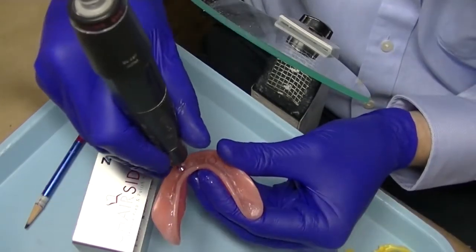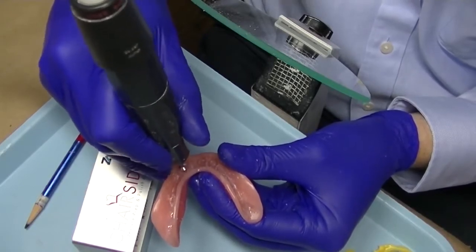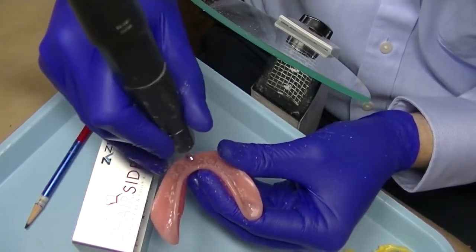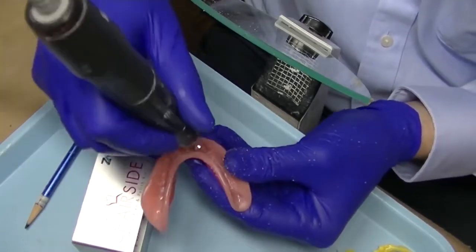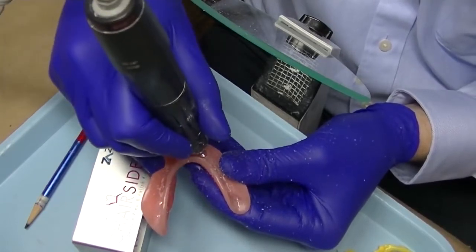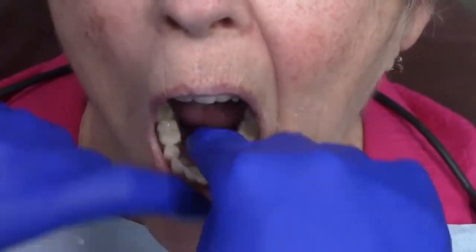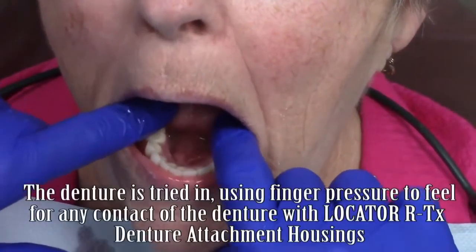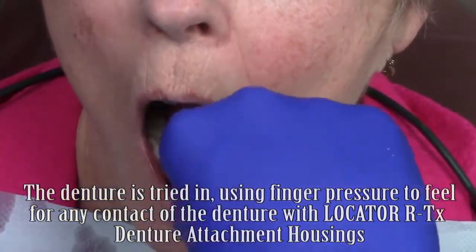Any areas of show-through are very easily adjusted and modified using the chair side recessed burr. The recessed burr is perfectly sized both in depth and in width to correspond with the Locator RTX denture attachment housings. Taking the burr in a standard laboratory or clinical handpiece and inserting it vertically into the denture at high speed will prepare the recess perfectly. The denture is tried back in the mouth, ensuring that finger pressure is used to feel if there's any contact of the denture to the housings.